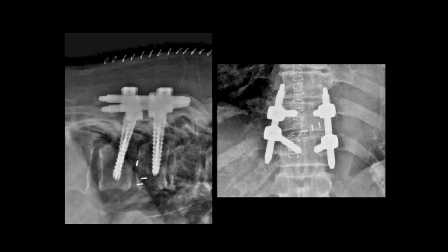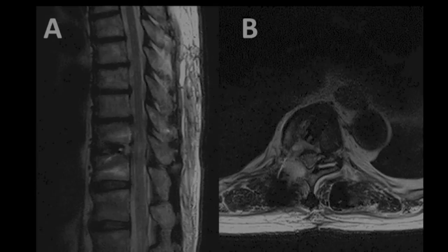Percutaneous rods were inserted, compressed, and locked. The contour of the whole construct was then checked by biplanar fluoroscopy.